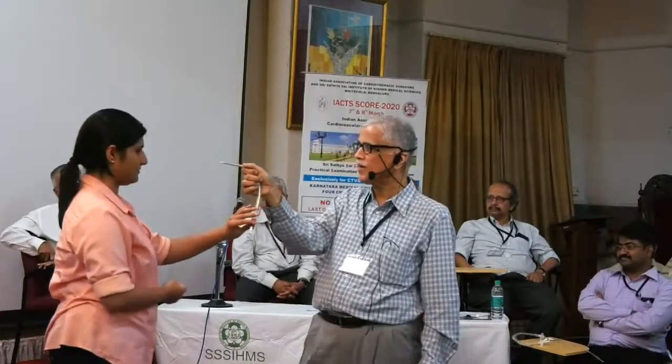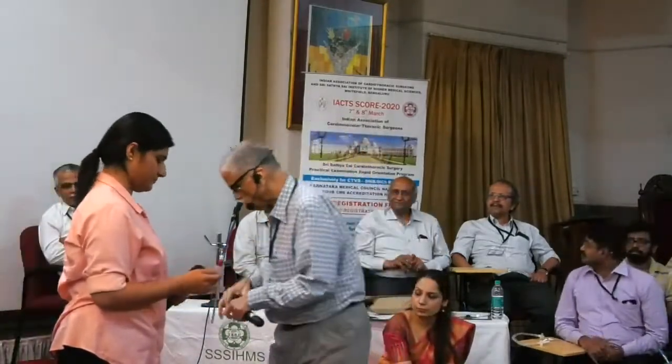Is it for the Seldinger technique for the cannula? I tell you, this cannula is designed for the Seldinger technique. She is not seeing the tip on the screen. So this is basically designed for the Seldinger technique for peripheral cannulation. Okay? What is it?